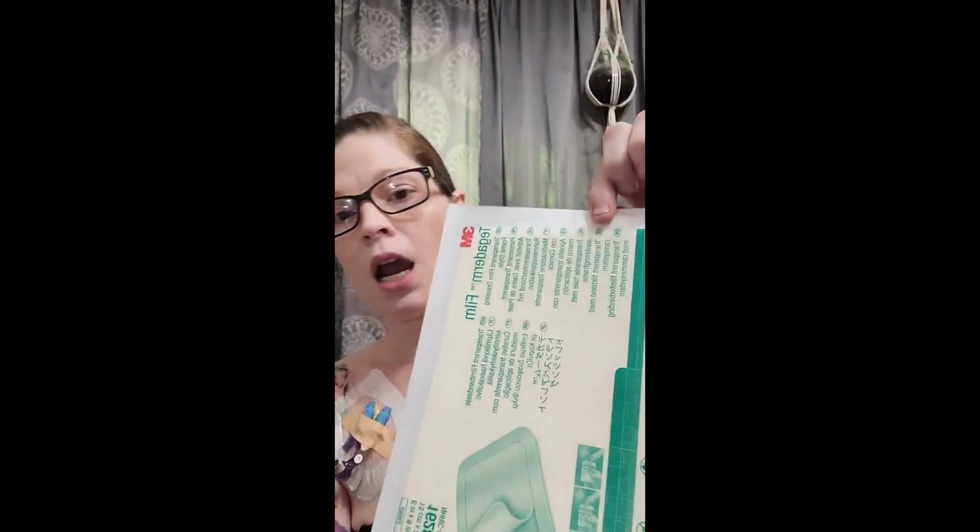So for my very sensitive skin, I will be using a skin prep. And I like to put this on before I get my Tegaderm ready, because the skin prep is going to take a little bit to cure. And while it's curing, I can get my Tegaderm ready to go. So I will carefully open my skin prep. It is liquidy in there, so you don't want to drip it all over.